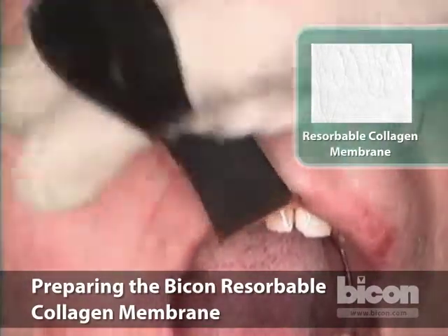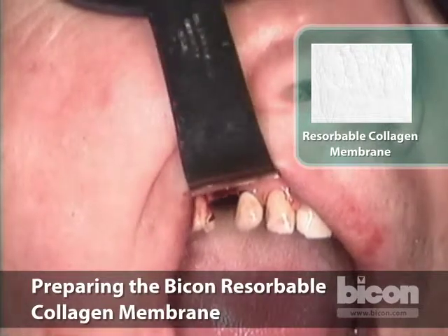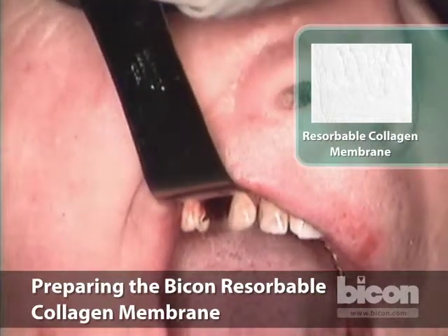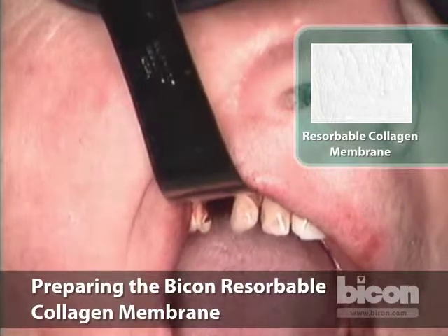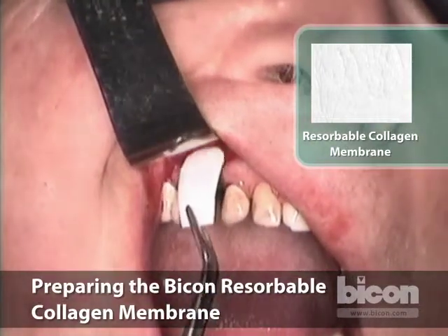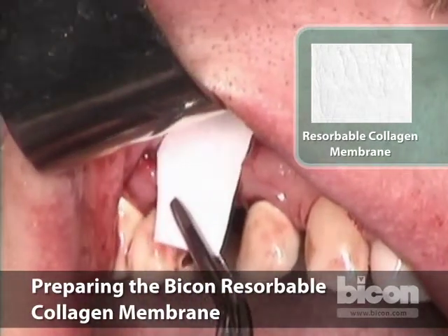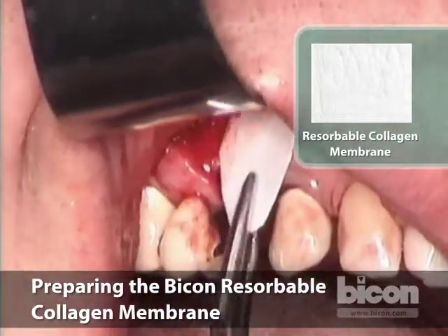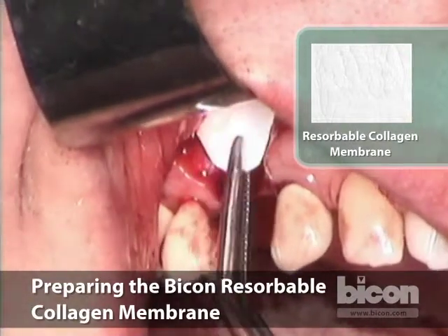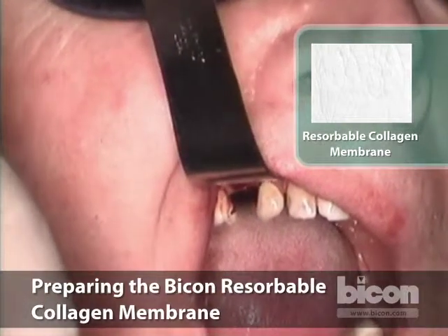Then we will take, since this is sterile paper, okay, we will cut an approximate piece and then modify it until we're happy with the size, and then use that as our guide to trimming the membrane. Okay, so all we need to cover is the very top. In this case, all I need to do is make it slightly shorter and slightly thinner. And that's it. This I'm happy with. It's away from the incisions, and it's going to cover the shoulder just exactly where we want it to.